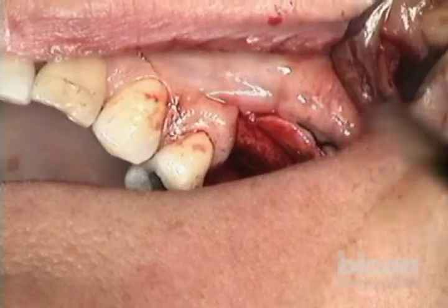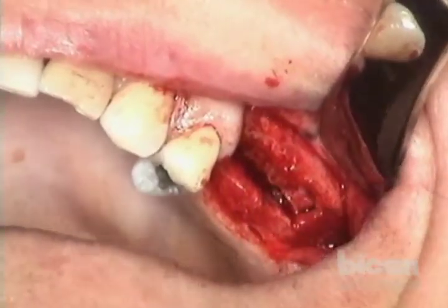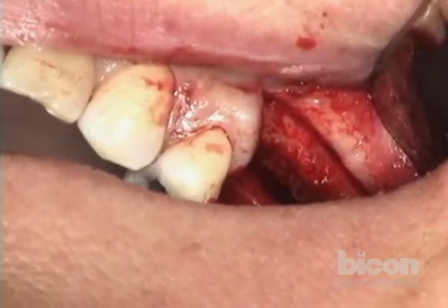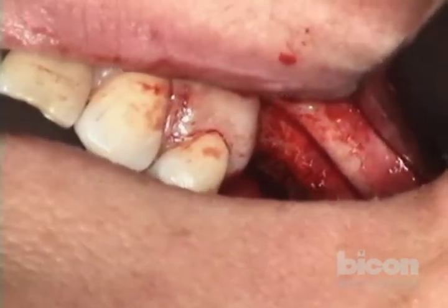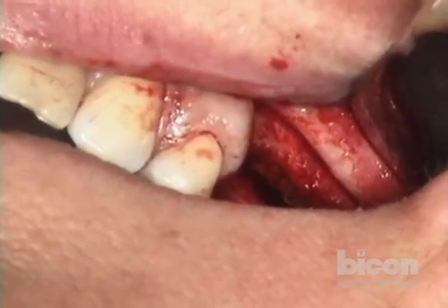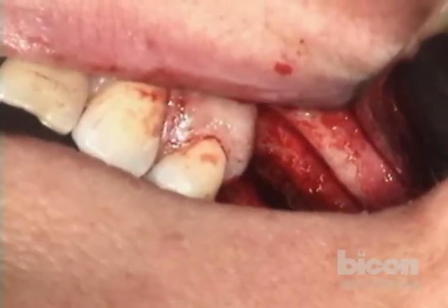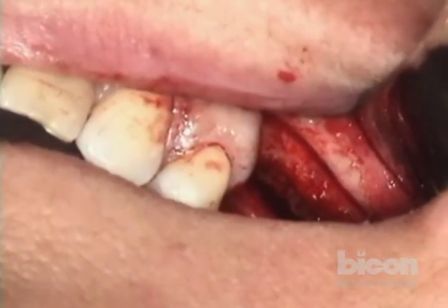We will now place the sinus graft and the implants. No suction in the area. We're going to use Synthograft fine. You can mix coarse and fine. Any questions for the audience?